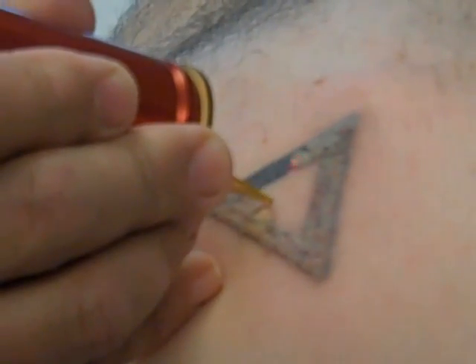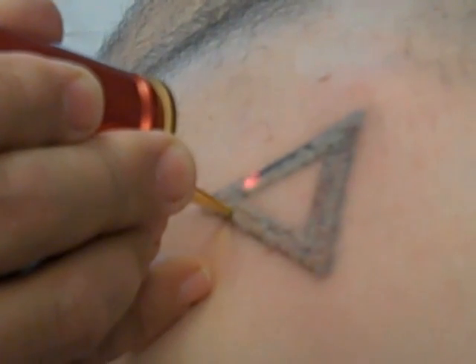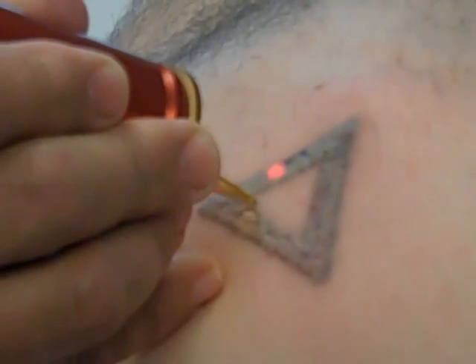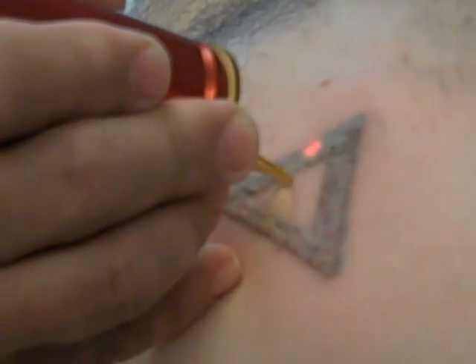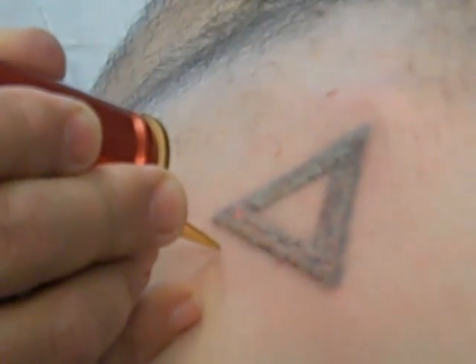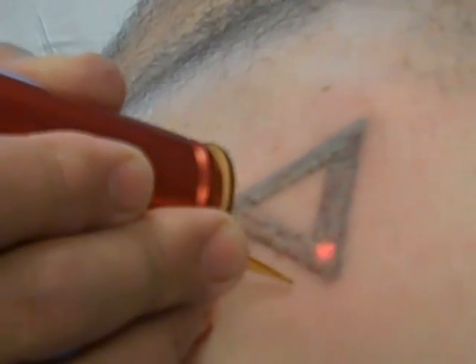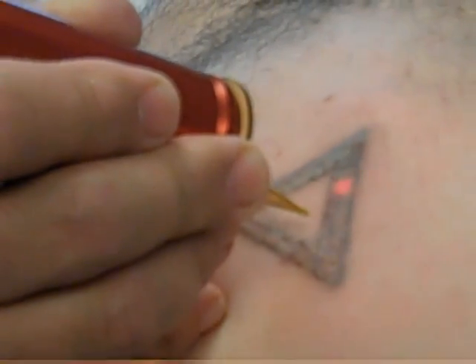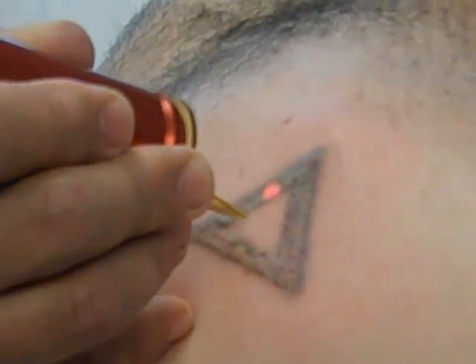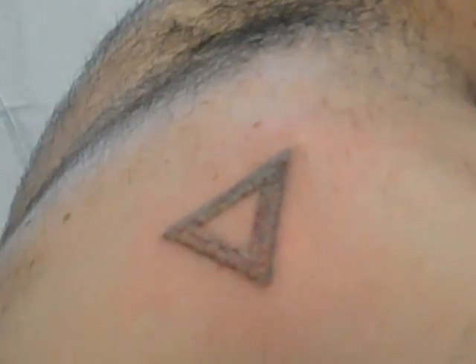Listen to the snap in the areas that have not been treated yet today, and then you'll notice if I try to go over an area that's been treated, you don't hear the snap as much because the laser beam has already been absorbed into those tissues, and this laser beam is not absorbed into white or gray, which is the temporary color change that we have. It only gets absorbed into the black. Done.